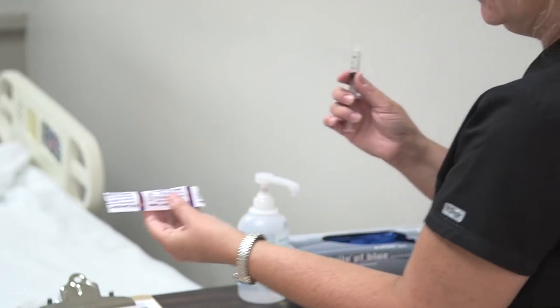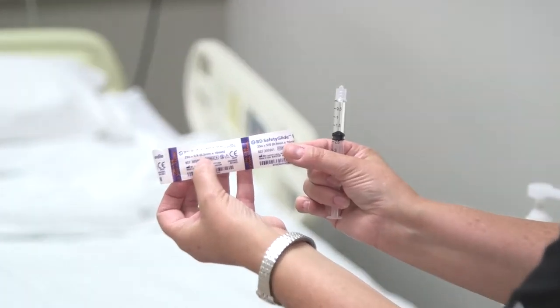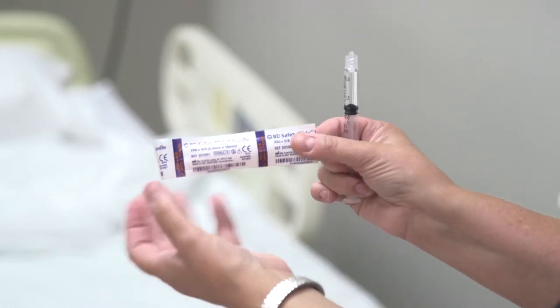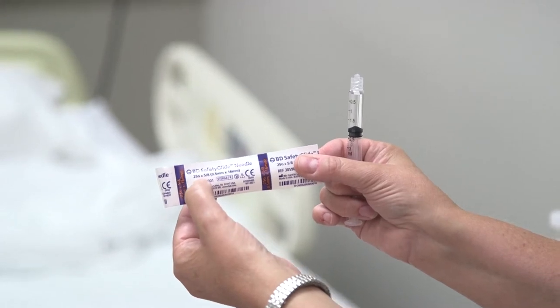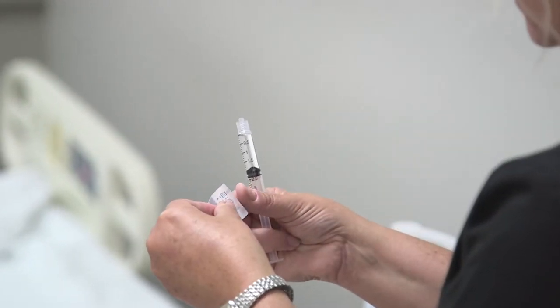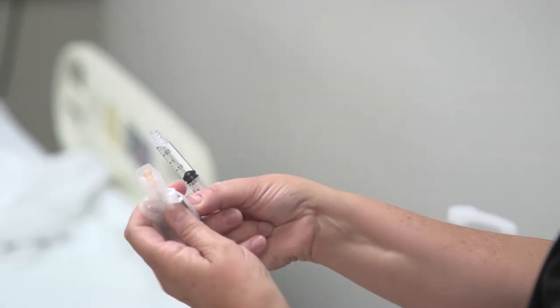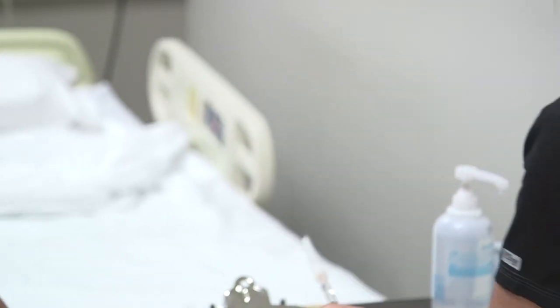And now you're going to use the needle that you want to administer the medicine with. So this is a 25 gauge, 5/8, which is appropriate. This medication is thin, it's aqueous, so it's not thick, it's not syrupy. So a 25 gauge is adequate for that. All right, so I'm going to go ahead and open this, if I can. There we go. Again, making sure you keep that sterile where you're going to be attaching the syringe. You twist that on and you have it ready to go for when you go into the patient's room.